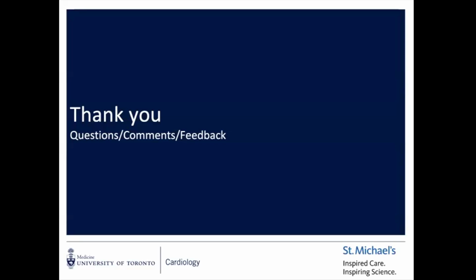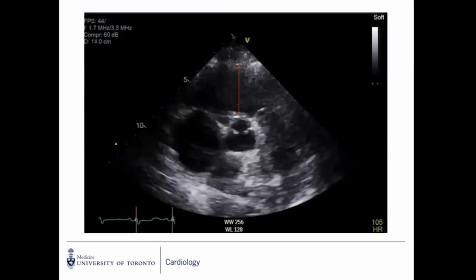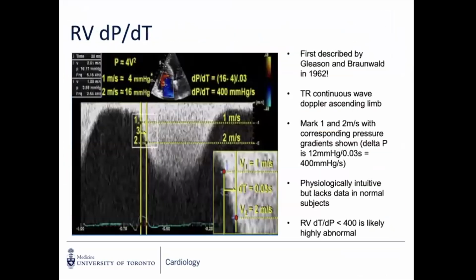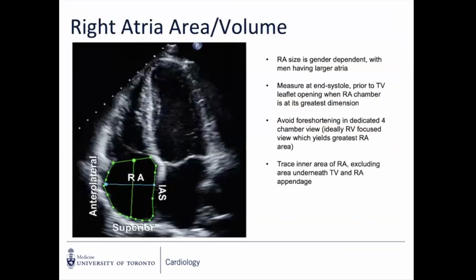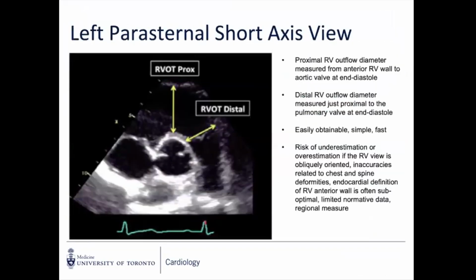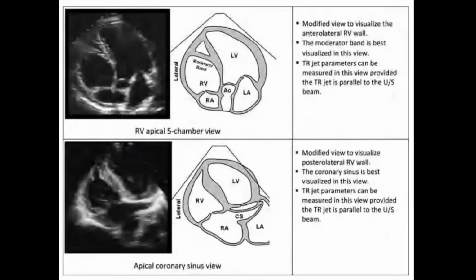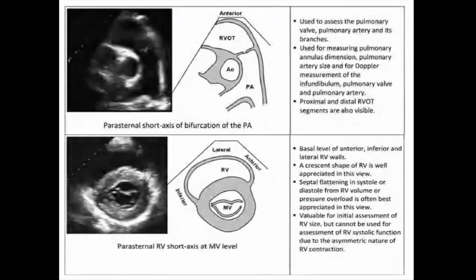So Shamon, can you go to the short axis? Just want to point that out. Historically, this is actually from Mass General, from Dr. Levine. Because we were in Boston, that was known as the T sign, as in the subway. Do you have the short axis view of the RV at the papillary muscle or mitral valve level? Yeah. So that's what we have been talking about exactly. So we can point it out.